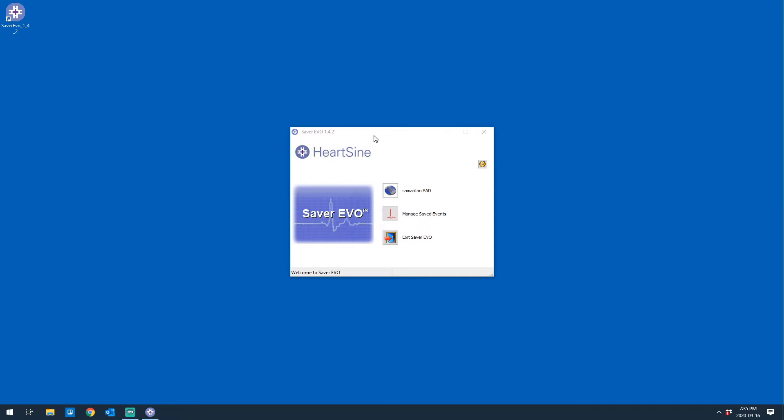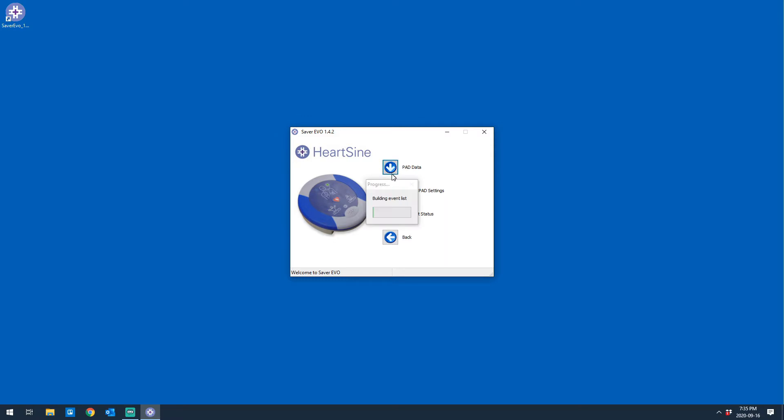So I've actually hooked up the AED to the computer by a USB cable, and I think it just fell asleep. Yeah, there we go. So I can actually dive into all of the different settings and events here, so time to wait for it to finish reading.